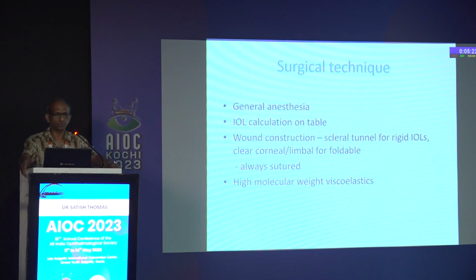General anesthesia is always required in a child. IOL power calculation is most often to be done on table, so therefore we would have to bring all our machines to calculate the IOL power into the theater.